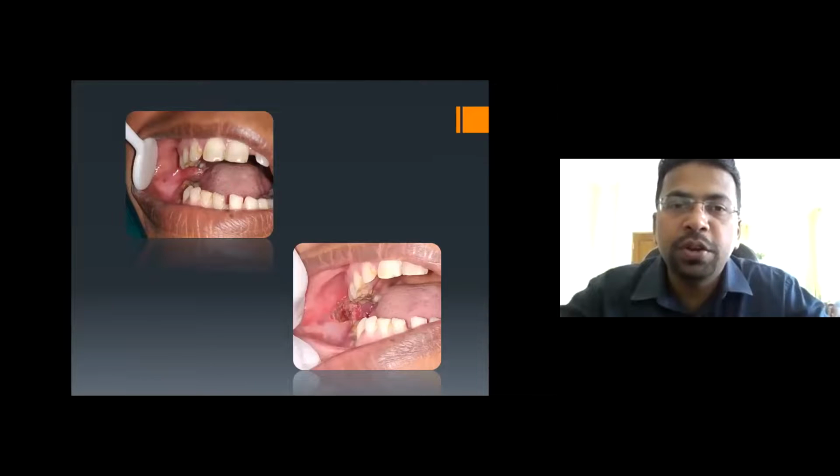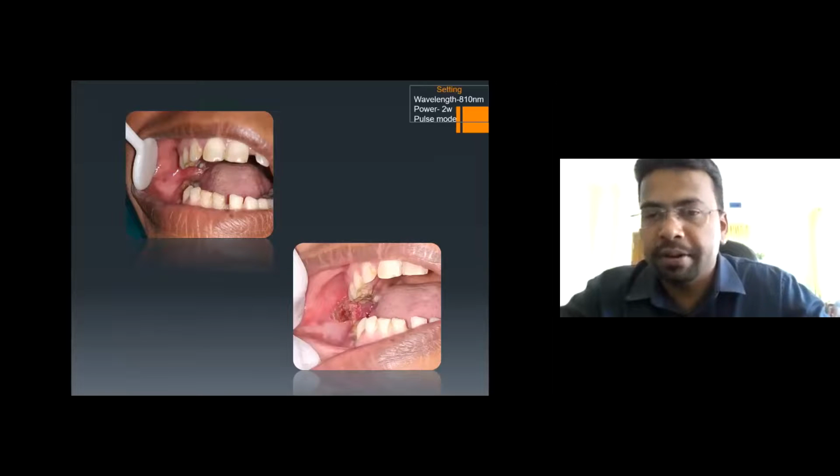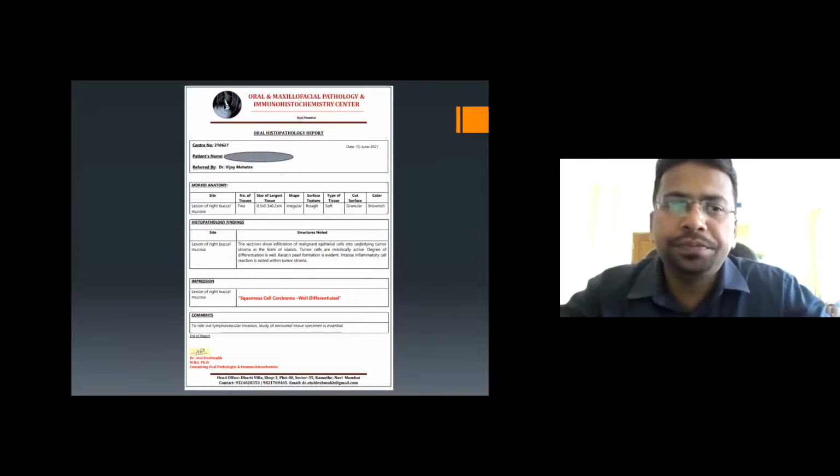This is a pre-operative photograph, and this is an immediate post-operative photograph after biopsy. And we can see in the biopsy report, we can see it as a squamous cell carcinoma, and that is well differentiated. Okay.